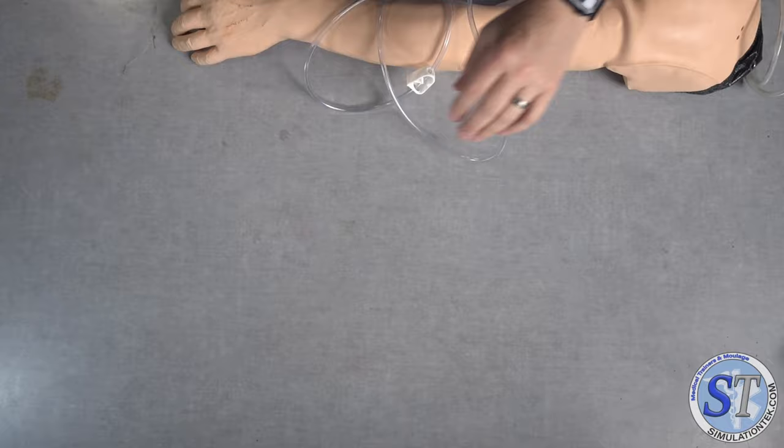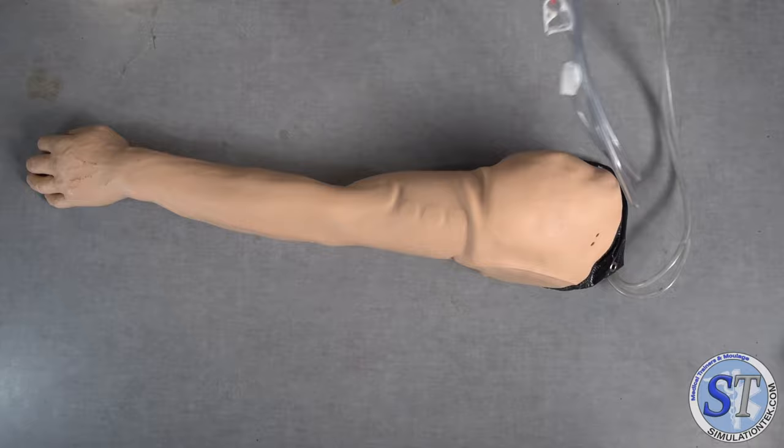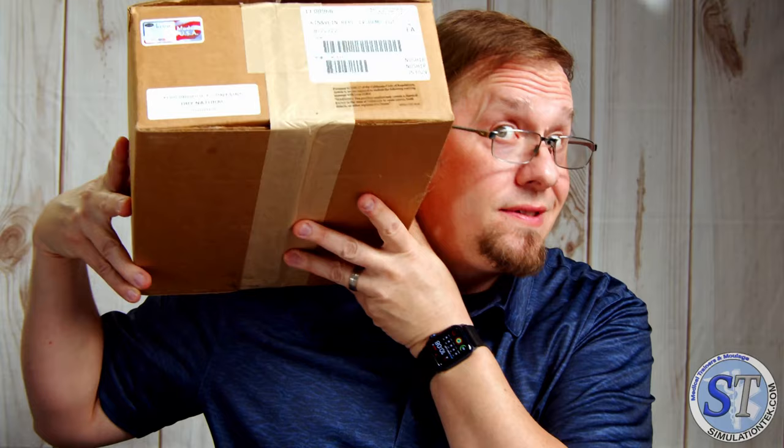It's got the bag still attached to it, and it's ready like that. So first thing I'm going to do is probably discontinue the bags. Just pull them off, put those to the side, and then we're going to look over the arm, see what condition it's in first. I actually have with me a brand new set of skins, tubes, and all that stuff if we need it, but I've also got other stuff if we don't think we need that.